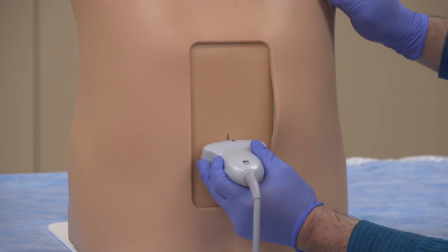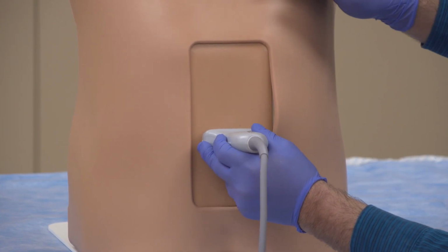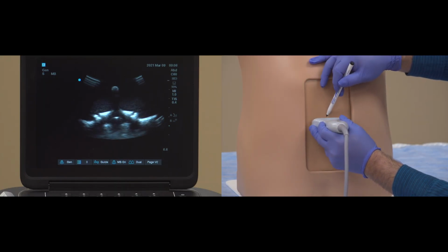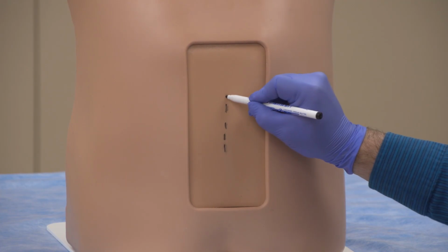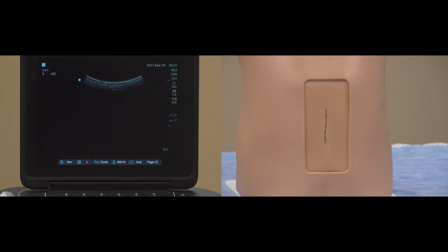Slide up to the next spinous process and repeat. Slide up and repeat once more. You have now mapped the spinous processes of L3 through L5. Connect the marks. Next, we will confirm the midline in the longitudinal plane.